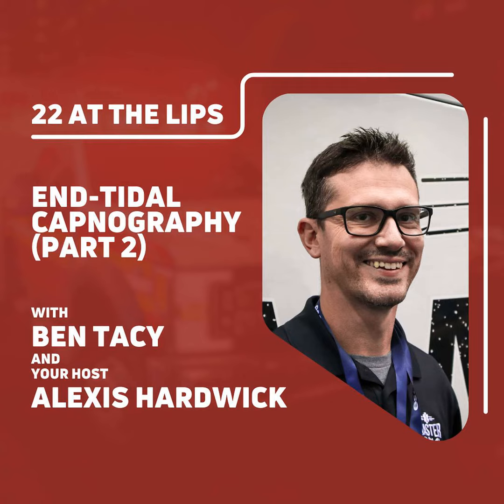And it's like, woo, we got him back. Guaranteed, it's there. But now the kicker to that is that it does not always occur. That will occur whenever there is a VQ mismatch. But if there is a very short downtime, and probably a lot of listeners have seen this, it's a quick cardiac arrest. You get them intubated, you put them on capnography, and it's like, holy cow, it's 40. That's weird. That's indicative of a short downtime.